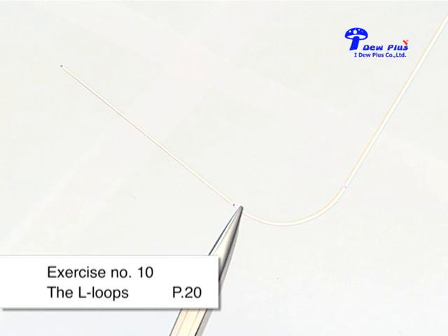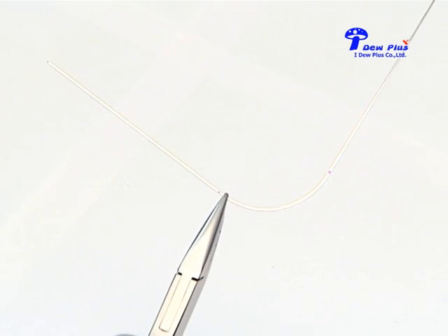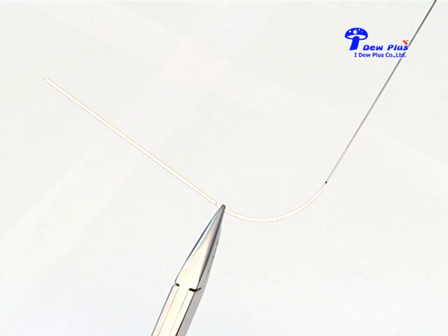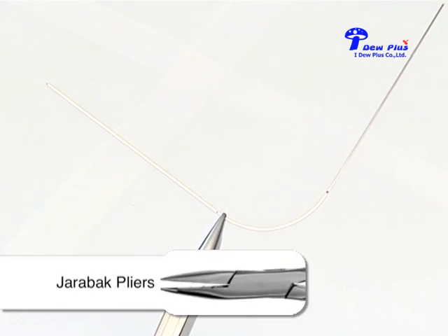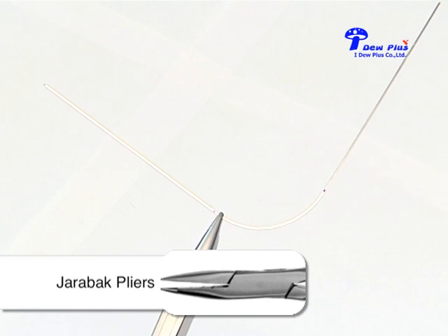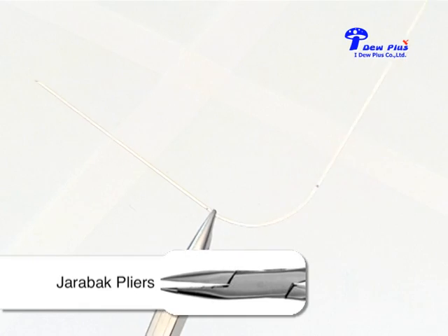The next loop we use is the leveling loop. Exercise number 10, the L loop. The wire selection is 16-22 for demonstration purposes. We can use the L loop as a leveling loop or an intrusion step by adding two L loops at points 2A and 2B, as shown here.